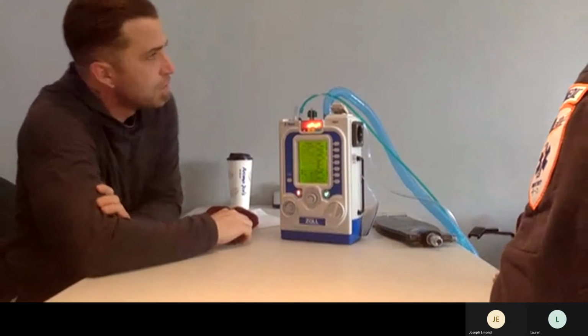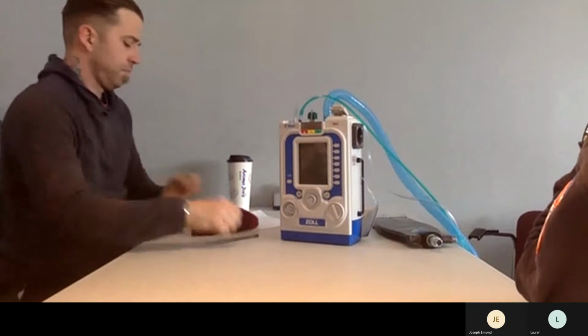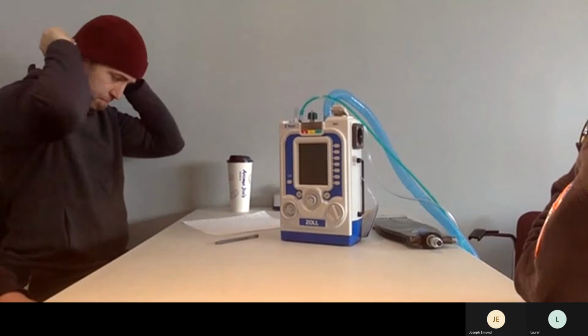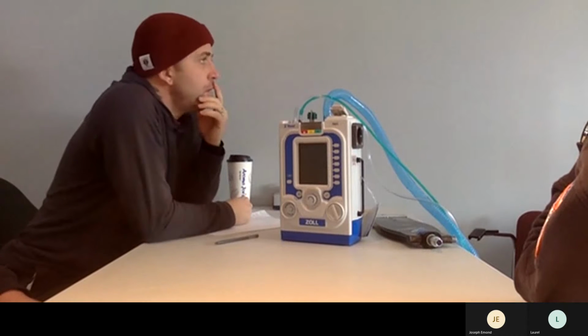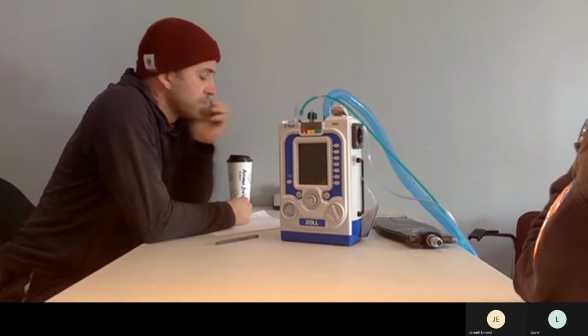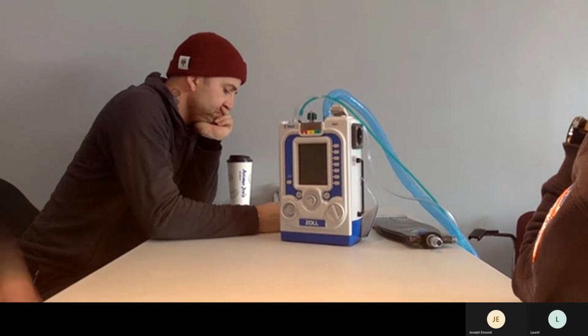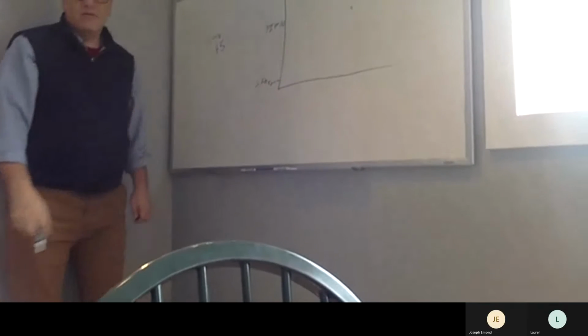I also now have an EPAP of 5. This machine will do SIMV at a non-supported rate of 0, which means I just have PEEP. That's CPAP. Everybody on board with that? I can SIMV at a rate of 0 and add 5 pressure support. So my peak inspiratory pressure will then be 10: 5 plus 5 is 10. Everybody on board with that?